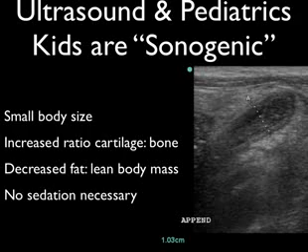And as opposed to putting a child who's squirming around in a CT scanner where they have to sit still, you can actually plop the child right down in mom's lap and scan the child right there without any sedation at all. So you don't need to sedate them, which has risks. Whenever you sedate a kid, you have to sort of control their airway, and it puts them at risk for a complication there. So we do it when we need to, but if we can avoid that, it's a good thing.